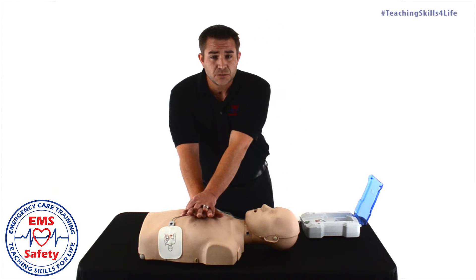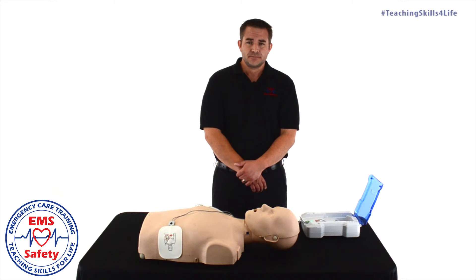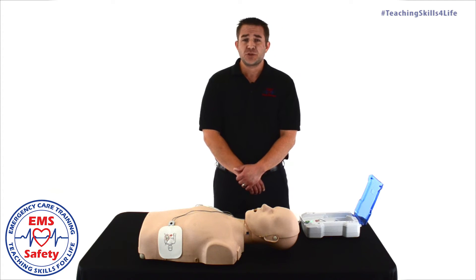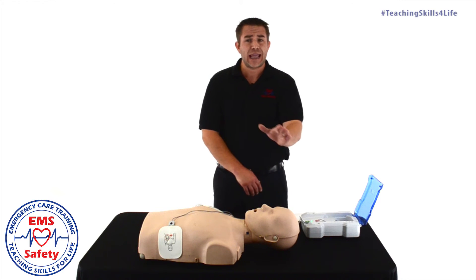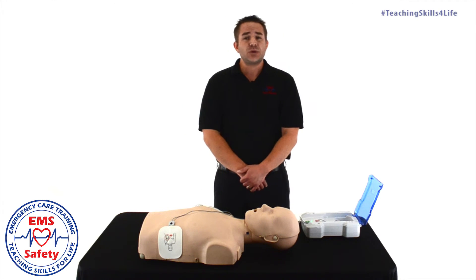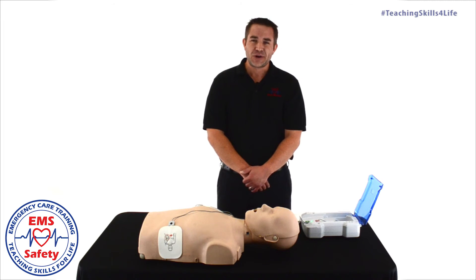The AED has directed us to begin CPR again. Some AEDs are going to have CPR tutorials, and as you heard, the AED is equipped with a metronome that's going to help us perform those compressions at the proper rate. AEDs are going to reanalyze this victim every two minutes, or approximately five cycles of thirty compressions and two breaths. CPR is hard to do and rescuers fatigue quickly. Every two minutes when that AED reanalyzes, that is a perfect time to switch roles and let somebody else perform CPR for a while.